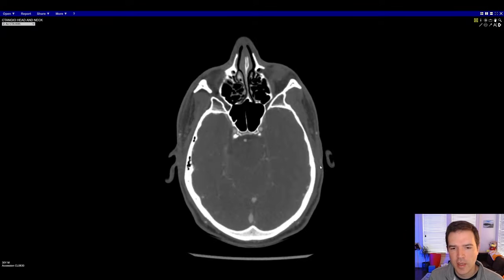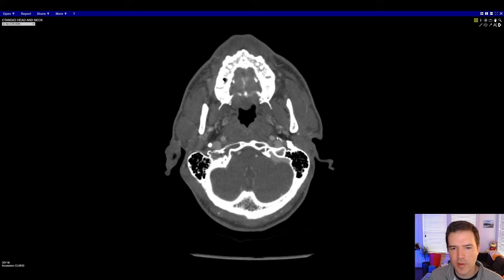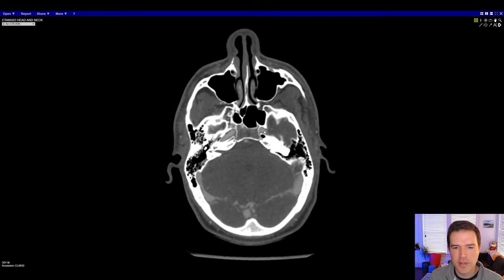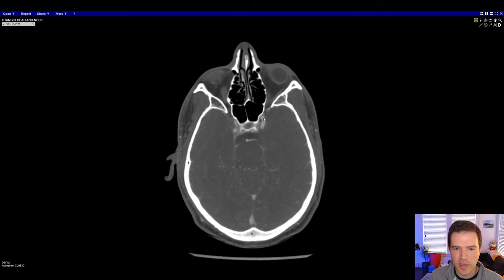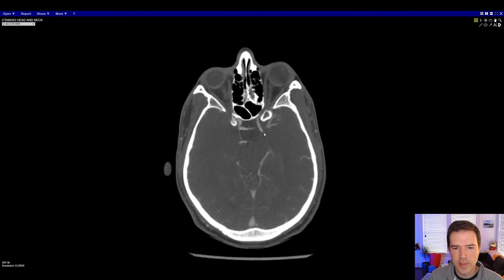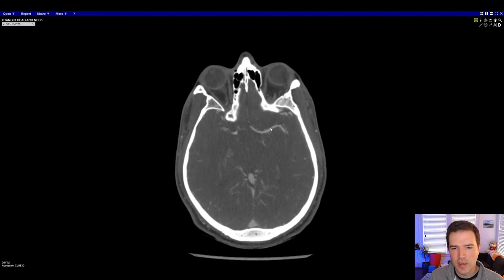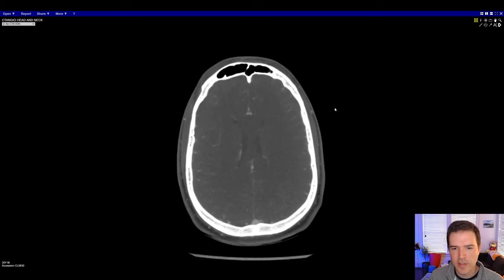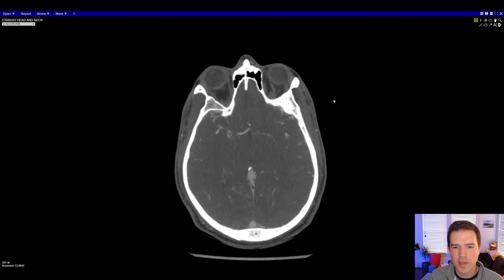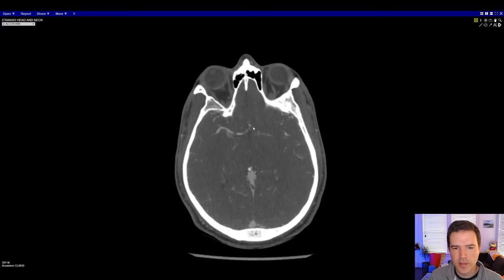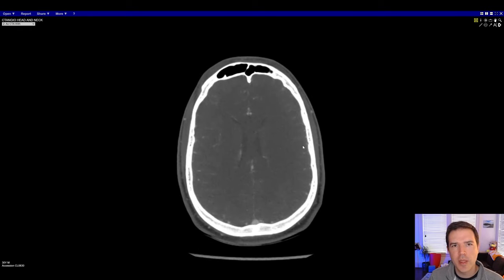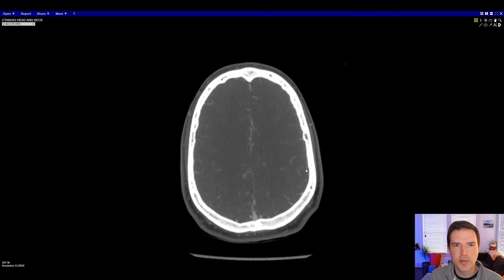We come back down to the skull base and do the same thing with the left internal carotid artery — through the petrous canal, turning anteriorly to become the cavernous carotid, ophthalmic carotid, and carotid terminus. It bifurcates into the MCA, which we follow up through the sylvian fissure looking for any abnormal vessels or abnormal truncation such as an occlusion. Then follow the ACA — the A1 segment and more distal segments — as it comes up along the falx in the midline.